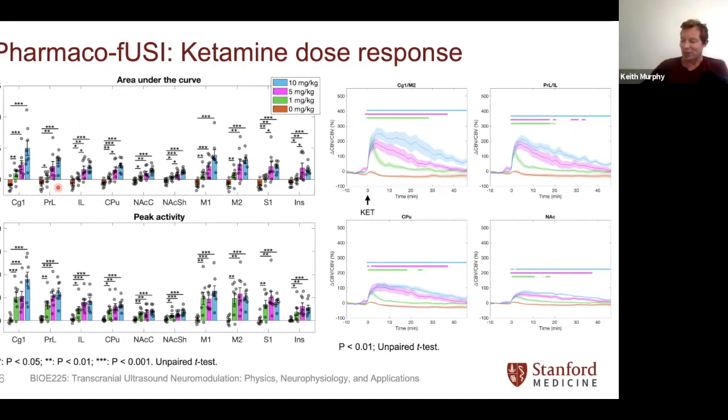It's interesting that a drug is just lighting up the entire brain, like nothing is suppressed. I don't know what that means, but it correlates with other imaging modalities. Yeah, I believe it. I'm just interested. If you look at CBV fMRI, that's something that people have looked at. It correlates pretty well with similar doses. And you've also done propofol.